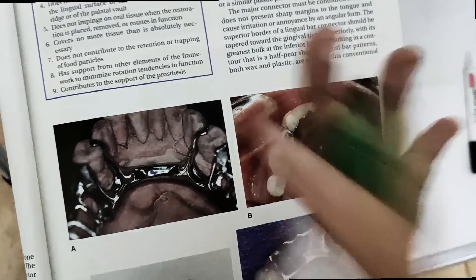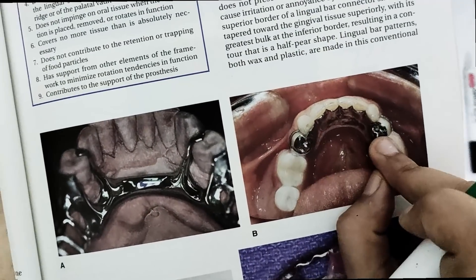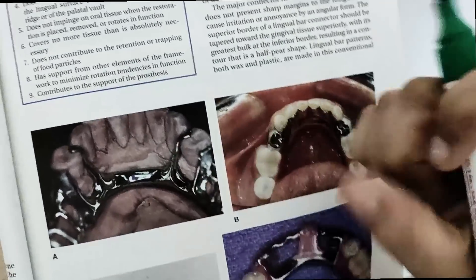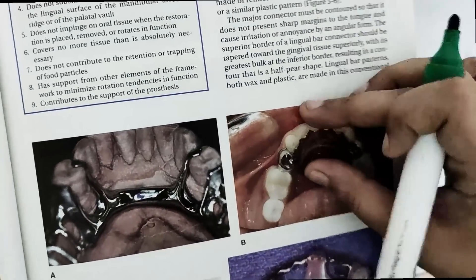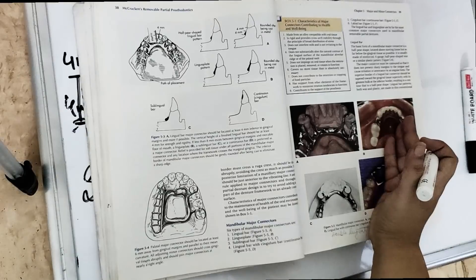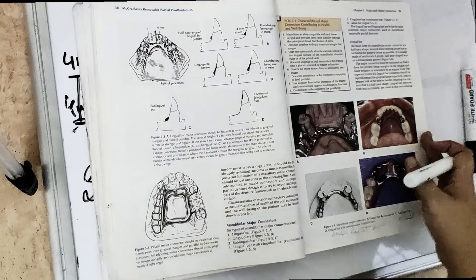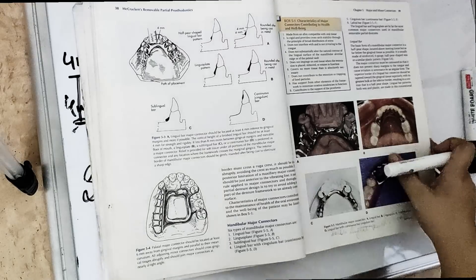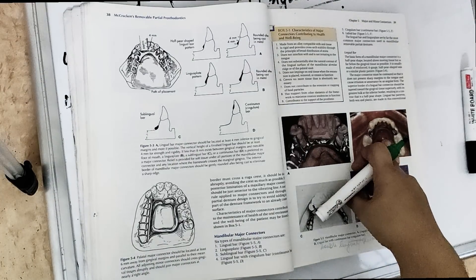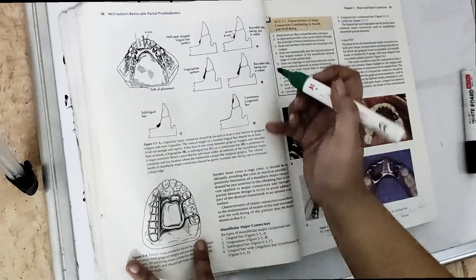The lingual plate can also act as a splint when anterior teeth have weak periodontal support. By combining all these teeth into a rigid framework, the teeth are no longer mobile. It is also indicated in cases of excessive vertical ridge resorption, Class I situations where the patient has undercuts in the ridges, and where the teeth are periodontally weak.